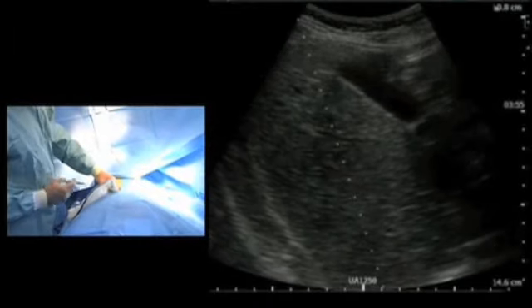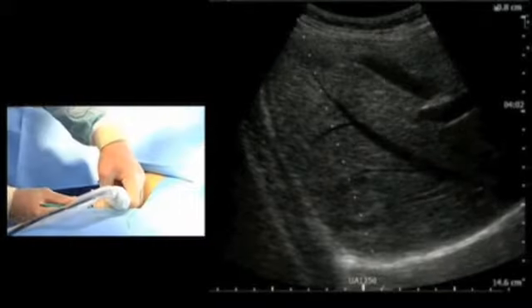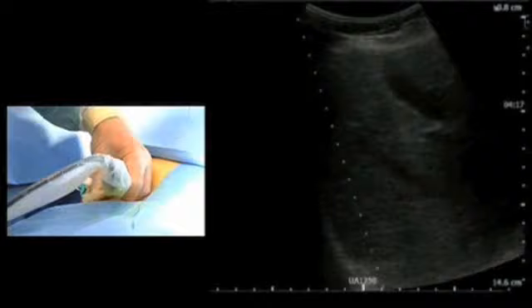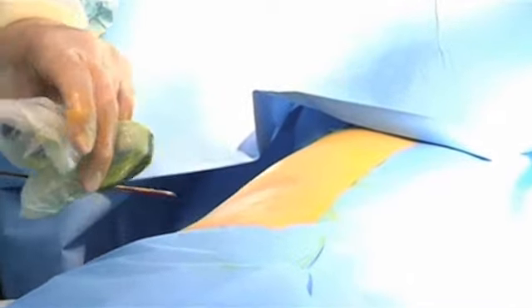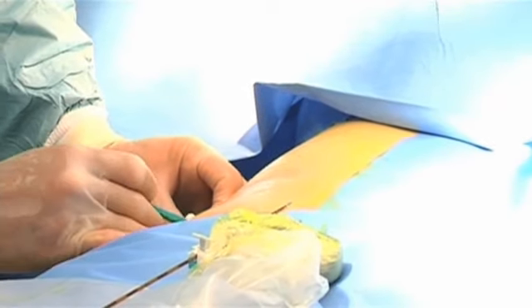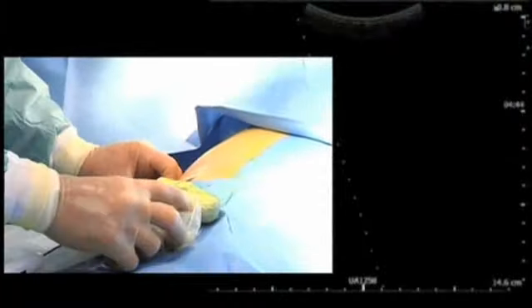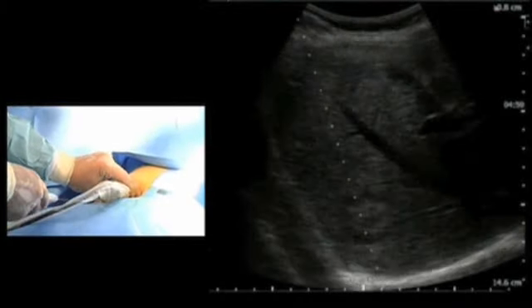Then I'm preparing it with a small incision when I'm using the ultrasound as a guideline. And then we will approach. Then I'm placing the needle in the incision, and if the incision is too small, because the needle needs to pass the skin without any obstructions, I just do it a little larger. And then we are approaching.